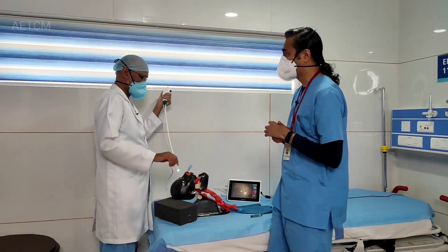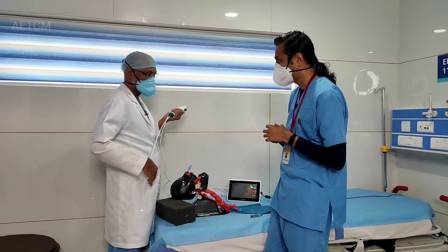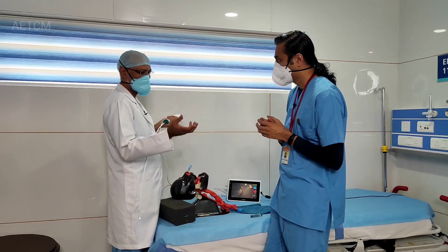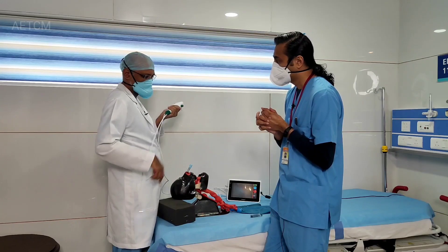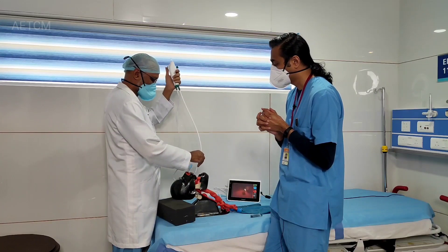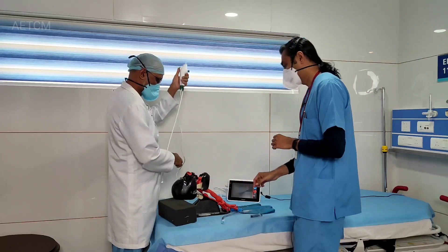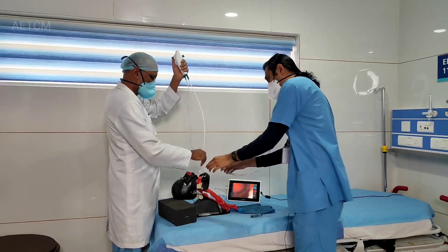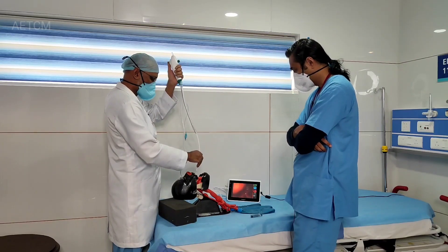Regarding the oral route, the same technique can be used, but orally it's technically a little more difficult. You could use certain conduits — we use special airways called the Ovassapian airway. That helps guide the scope up to the cords. Otherwise, what happens is the tongue keeps on moving all the time and comes in the way, and there's nothing to stabilize the scope until you reach there.